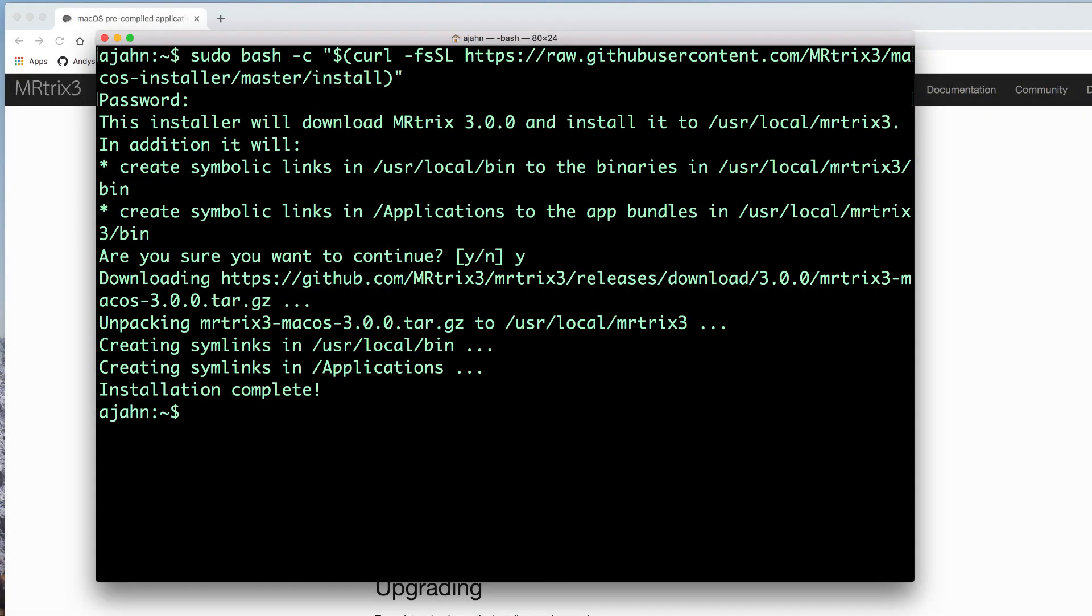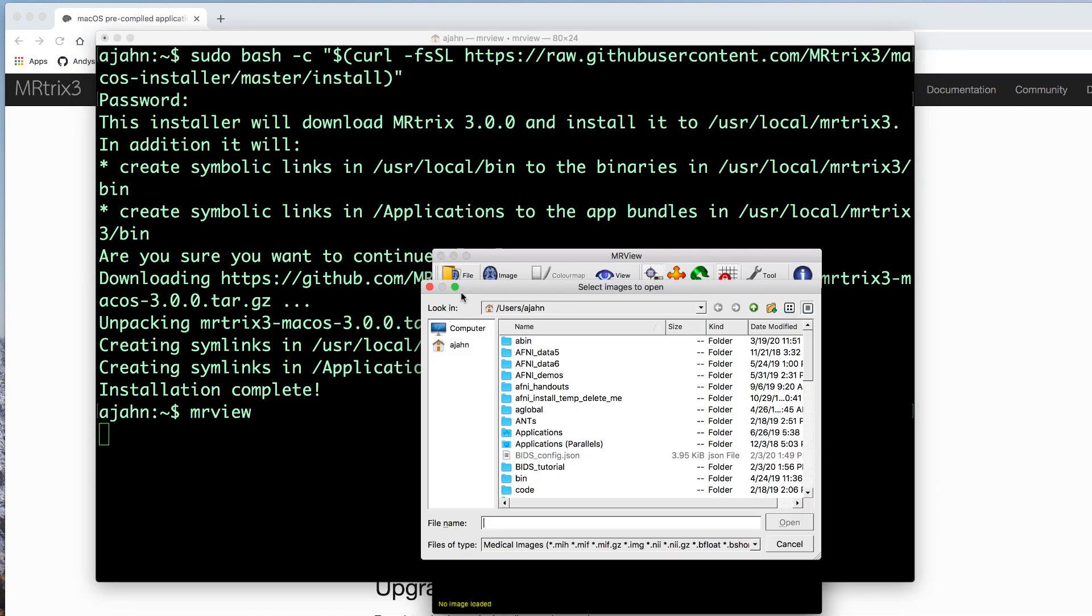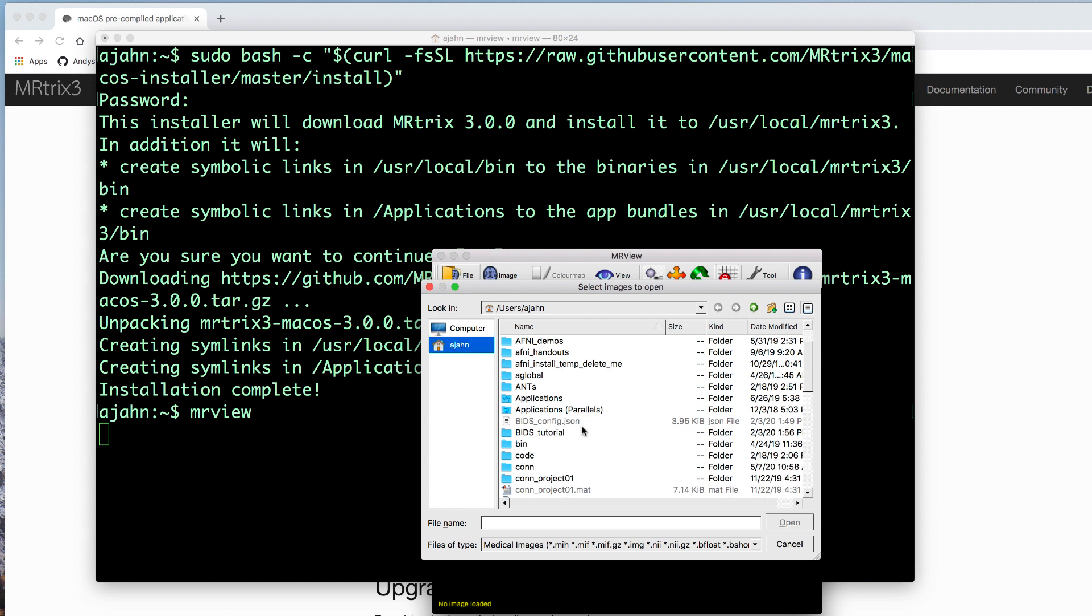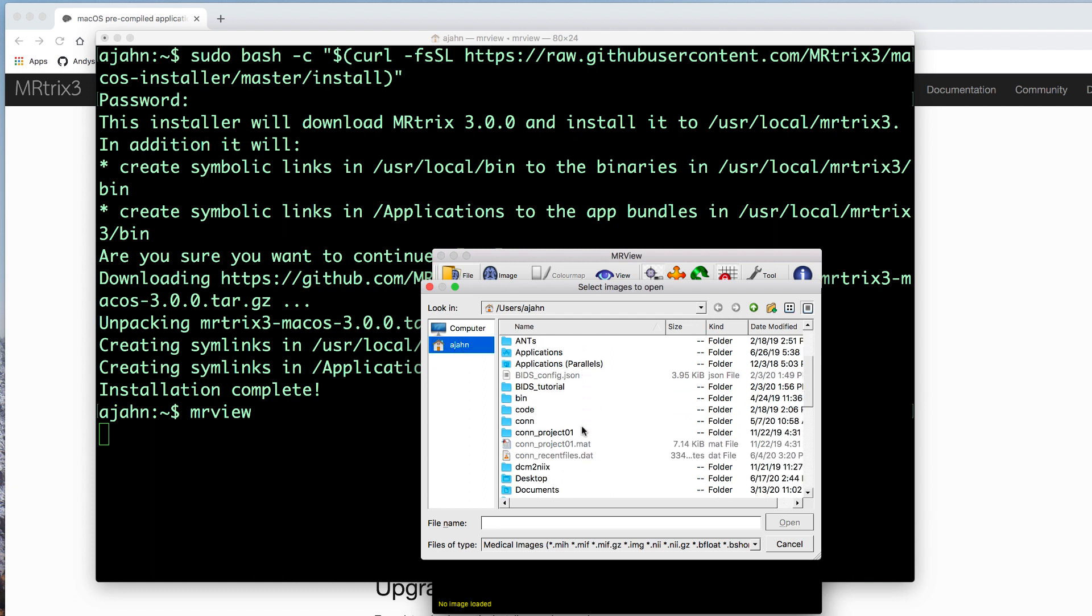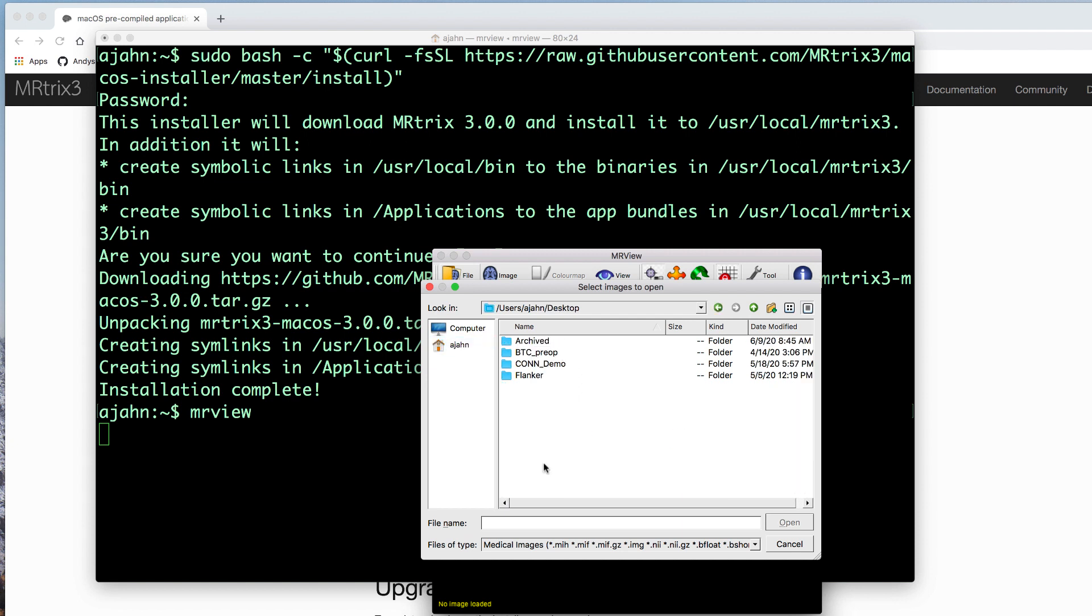Once it is downloaded, open a terminal and type the following to test your installation: MR-View. This opens the MR-TRIX image viewer, and you can open any nifty file you want. It could be a functional image, anatomical image, or diffusion-weighted image.